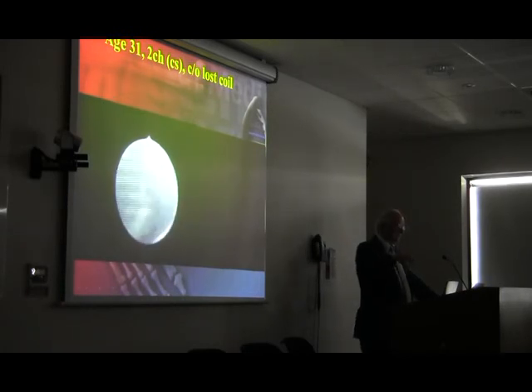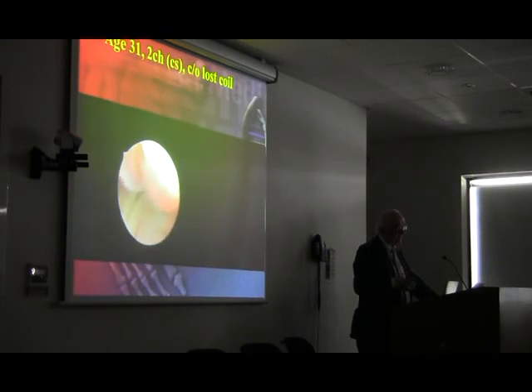So again, this is a vaginal approach here, just coming through, and you can see the cervix. You'll often see the cervix hanging down. Look at it hanging down there in the front, and you can see the little cervix opening. She's had two cesareans, so you've got a small, round cervix, but it'll still go in. This is a 5mm scope, and it'll go in okay. And again, you're looking at the posterior wall there of the endocervix.